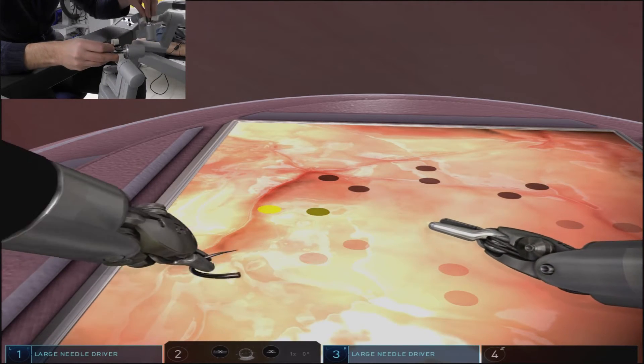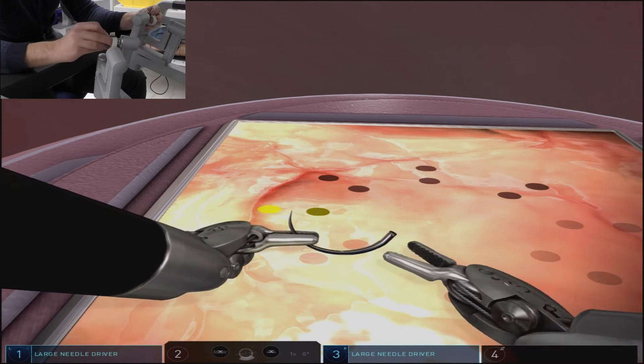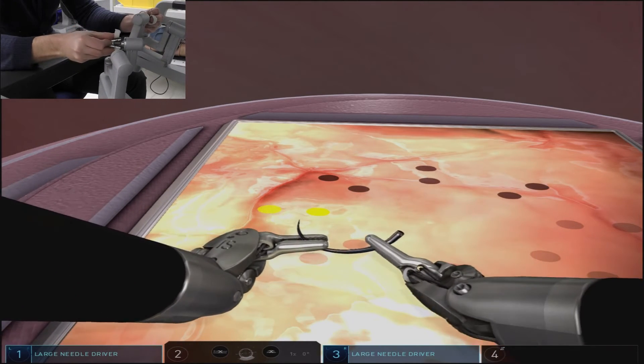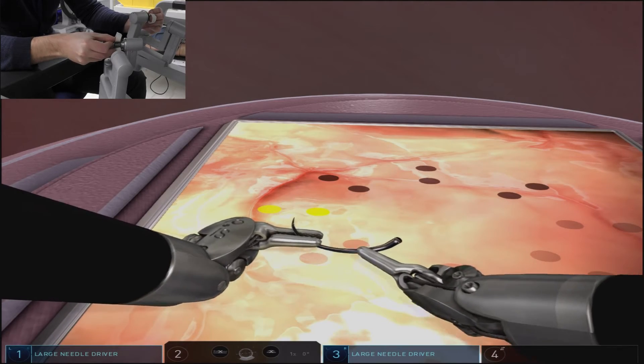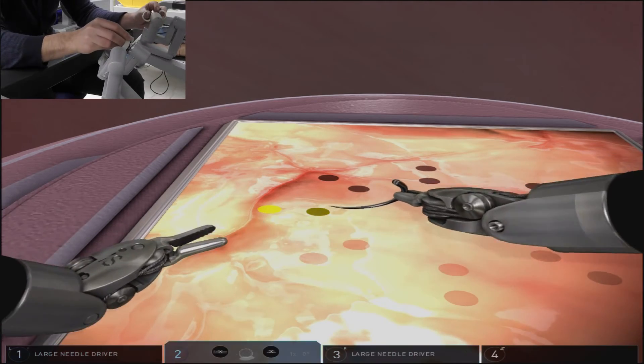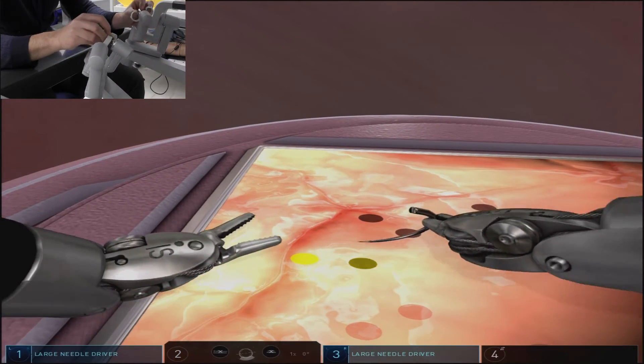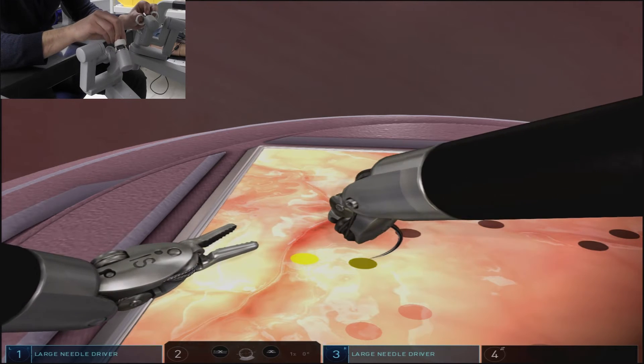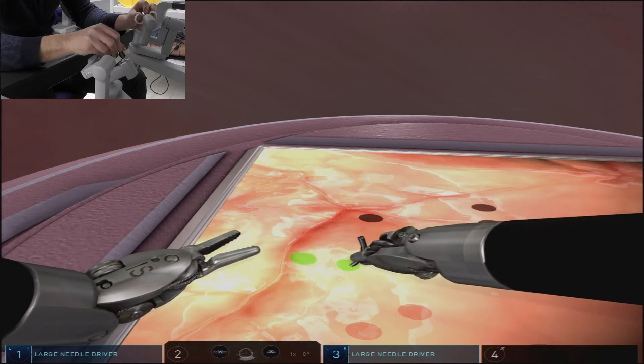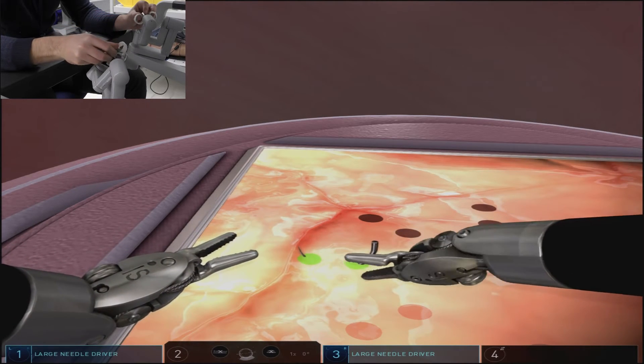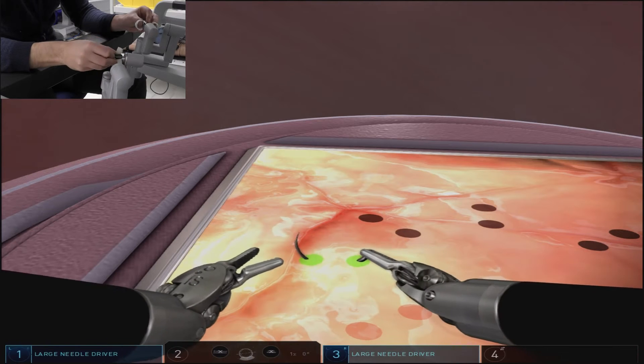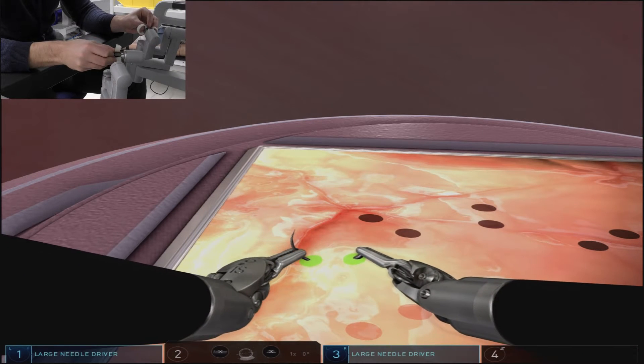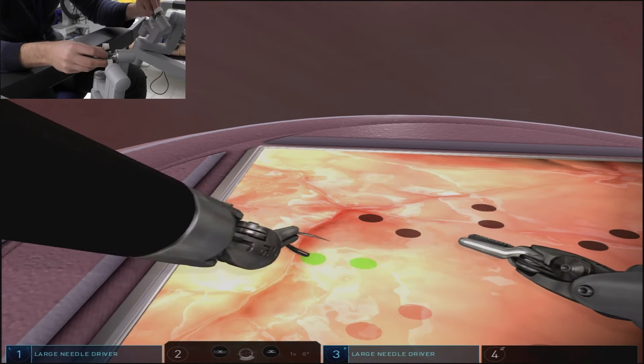However, you see we transitioned to the right arm for this next throw. Hand position is also important for setting up each throw. In this instance, we grabbed the needle in the supinated position. We then pronated it backwards to get good needle entry and then supinated through the throw to finish it.